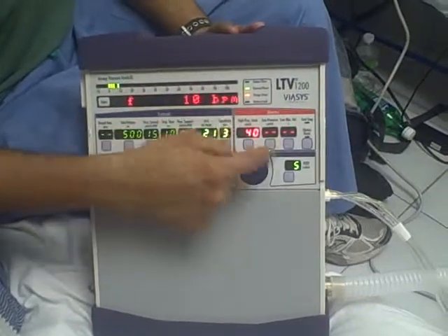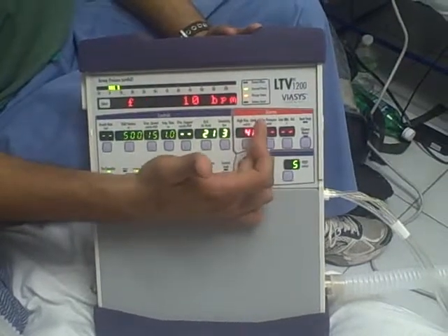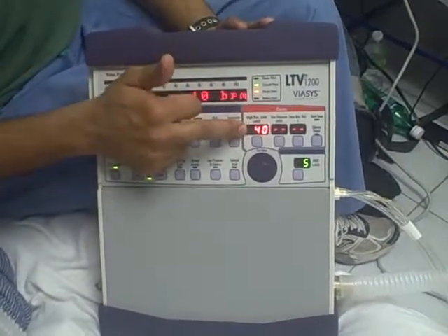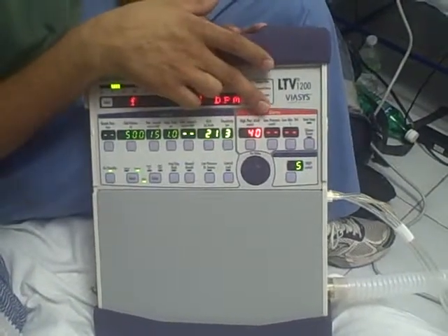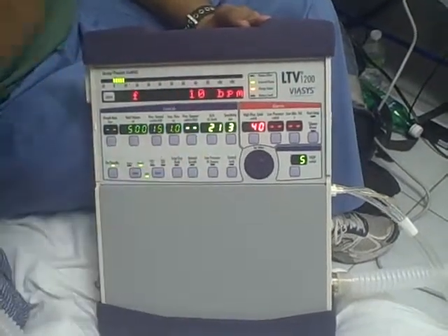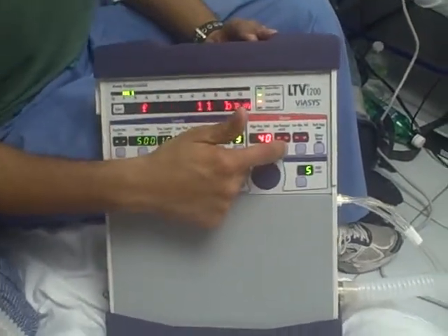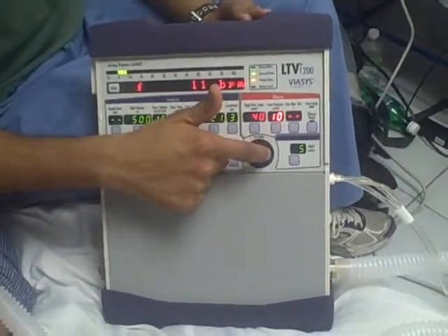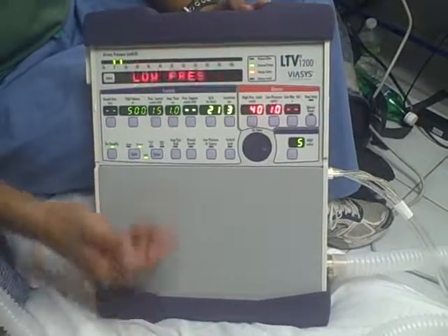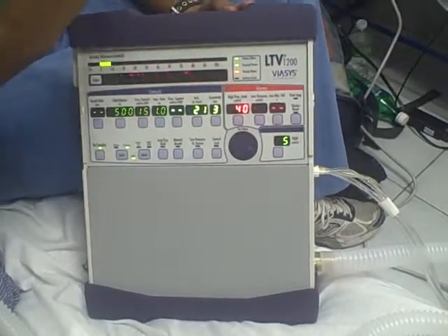There are 3 main alarms that are on the right-hand side of the machine, and these are the high pressure limit, the low pressure limit, and the low minute volume limit. As you can see, the high pressure limit is set at 40, and I've turned off the low pressure and low minute volume settings. That's because in BiPAP, because of leak around the mask, the machine will continue to alarm in these settings. Notice if I turn the low pressure up to 10 and hit select, pretty soon it's going to alarm for low pressure. Right on cue, it's alarming for low pressure because there's a leak around the mask, which is inevitable with BiPAP.